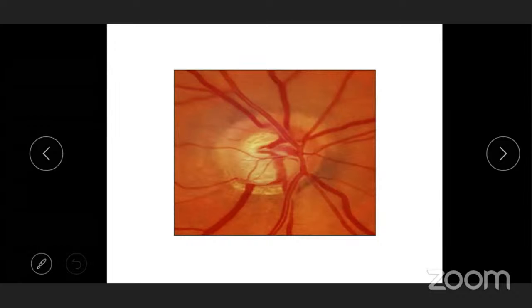The disc margin, always look for that. Then the disc size. Then you define the rim dimensions in all the four quadrants. Then look at the rim color. Then the RNFL defect, followed by the parapapillary atrophy, the beta zone. And then you look for the blood vessels and the disc hemorrhages if there are any. And lastly, you look at the asymmetry.